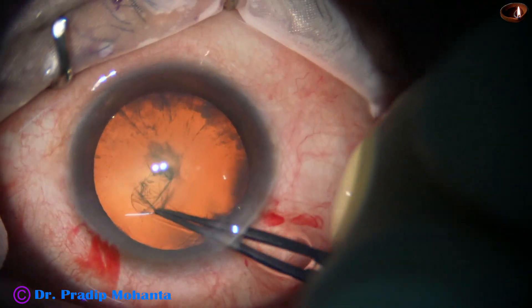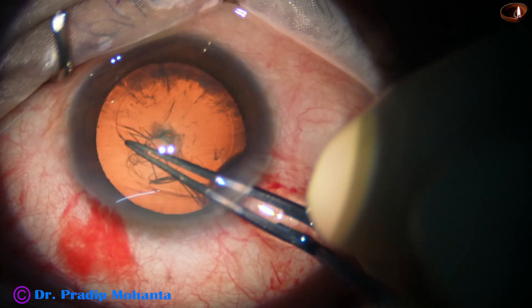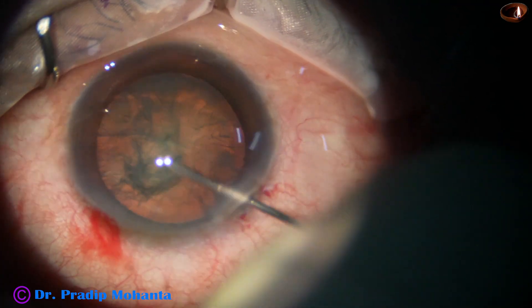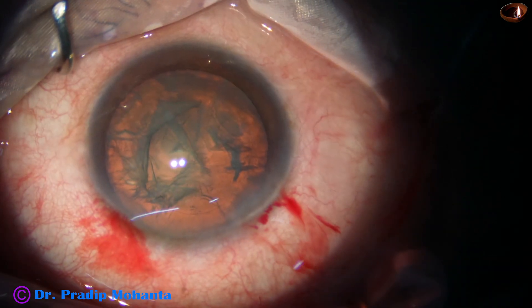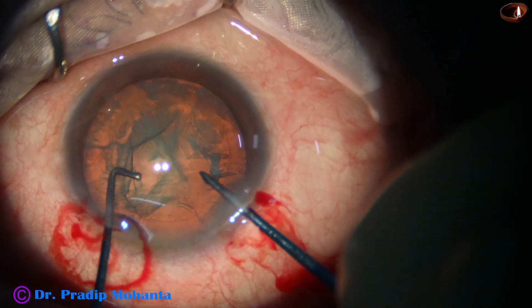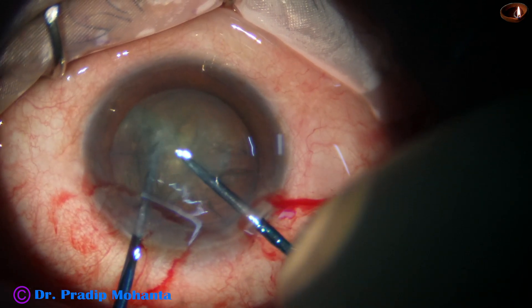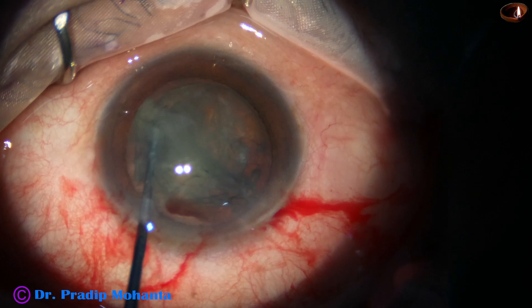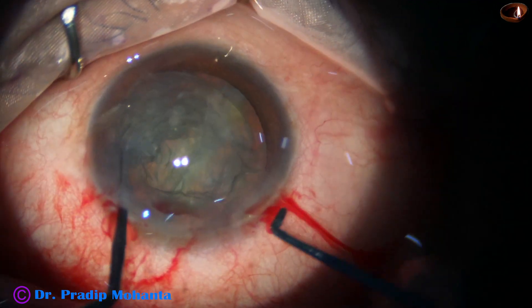This is the third case. Capsulorhexis is being done by the utrata forceps. The size of this rhexis is about 5.5 millimeters. Hydrodissection is done with a 27-gauge cannula. The nucleus is tapped but was not rotated much. Now the pre-chopper goes in, embedded just in front of the rhexis margin at the main wound — fully embedded, tip length is 1.8 millimeters. The sustainer hooks the opposite equator and the two instruments are brought together, but I find the anterior chamber is very shallow.